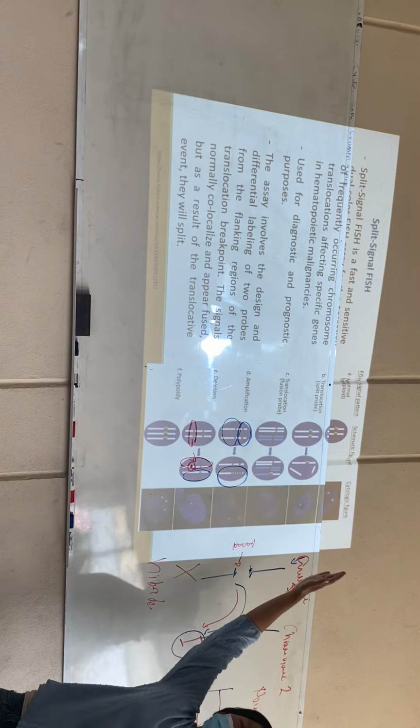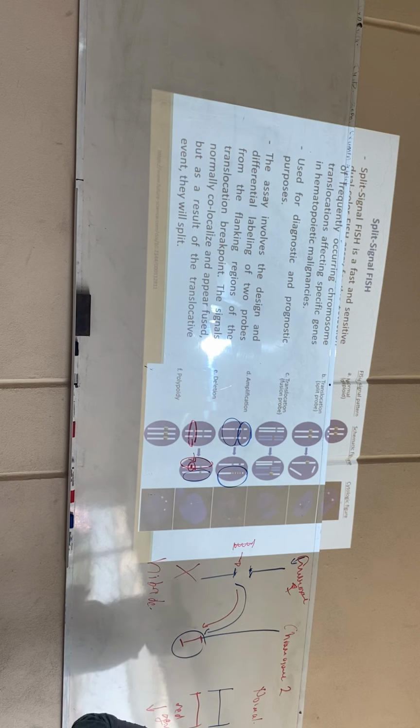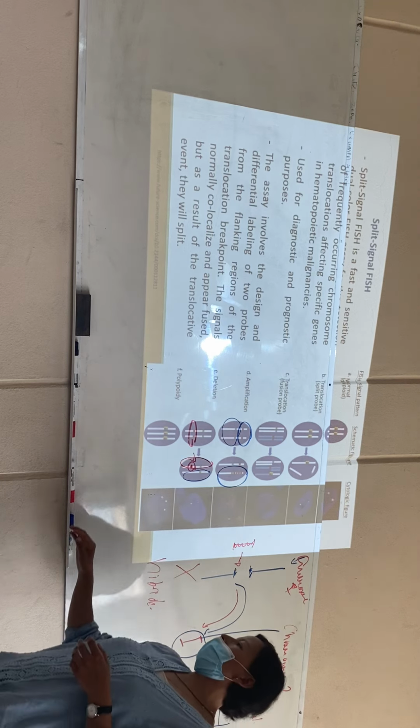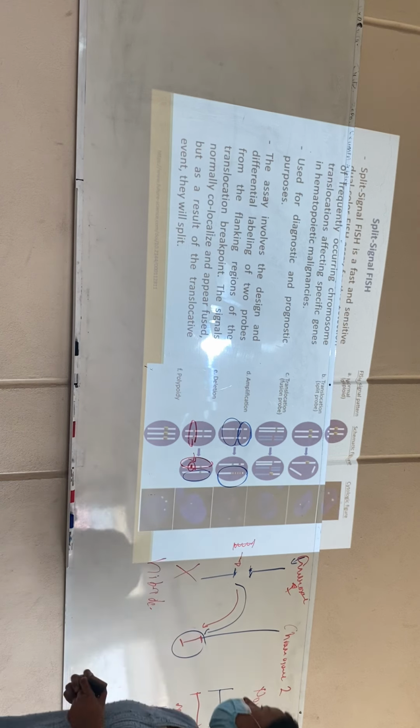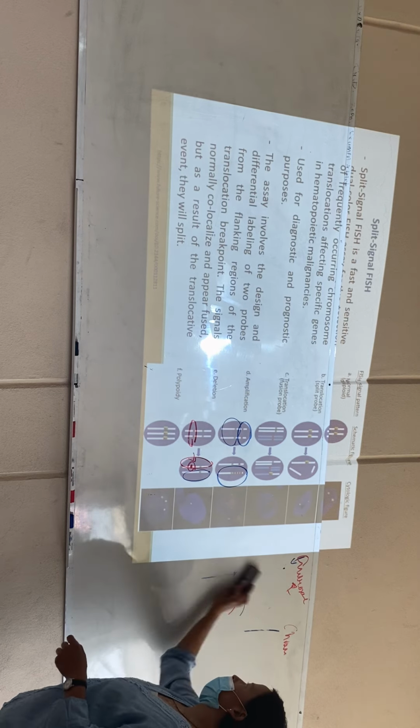So all of these modifications that I just highlighted here can be detected with fluorescence, or with FISH. And the name of this is split signal fluorescence. So I'm talking about intensities of fluorescence here.